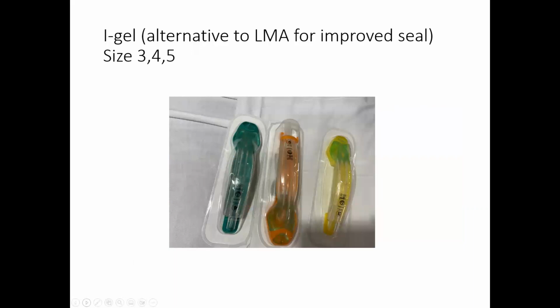Your I-gels are just pictured here, your different sizes, but the idea is it's very similar to an LMA, except you're not inflating it. Sizing would be similar to what you'd have with an LMA: 3, 4s, and 5s.